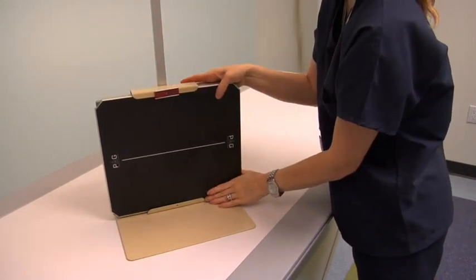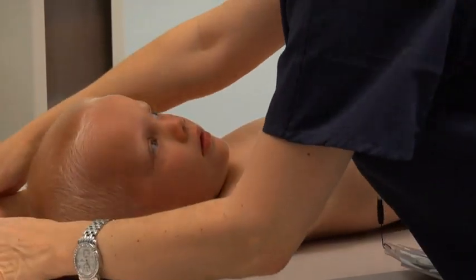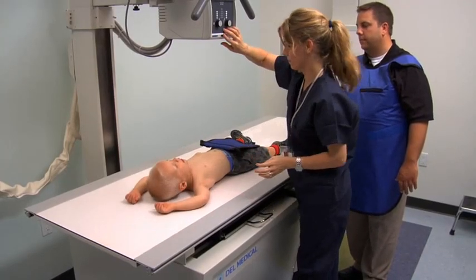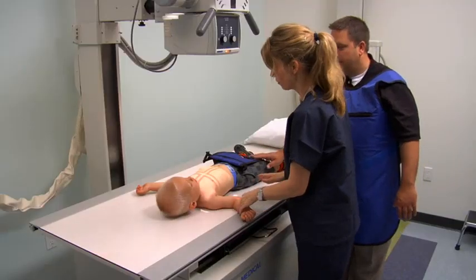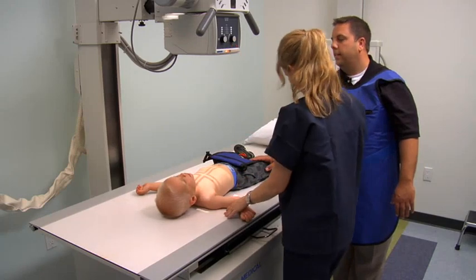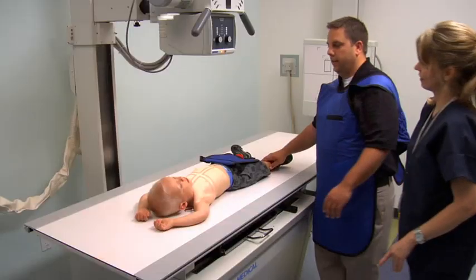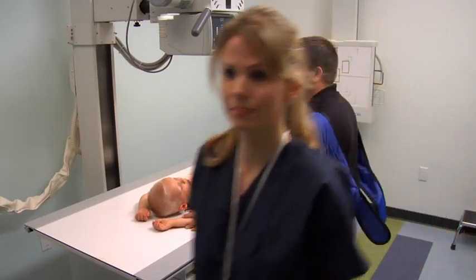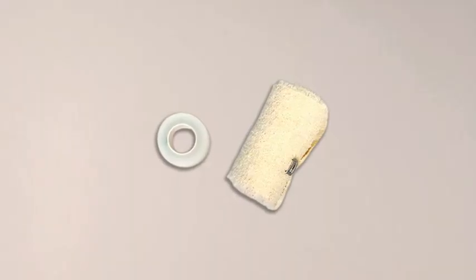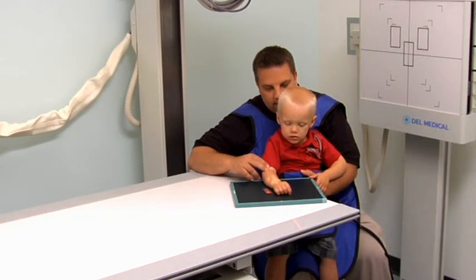In the case of pediatric patients, the radiologic technologist's attitude and approach to the child and guardian, as well as the technical preparation in the room, are important. Pediatric patients need the same basic X-ray projections as do adults, but care and attention to communication with both the child and the guardian is important to obtain optimum images. It is essential to either enlist the guardian's help to immobilize the child or to use immobilization devices such as sandbags, bandages, or tape in order to maintain the correct position. Caregivers must wear radiation protection if they remain with the child during X-ray exposure.